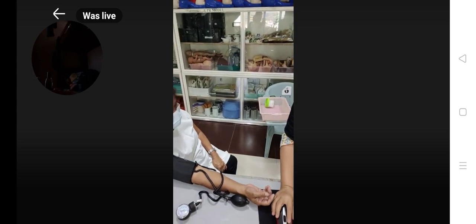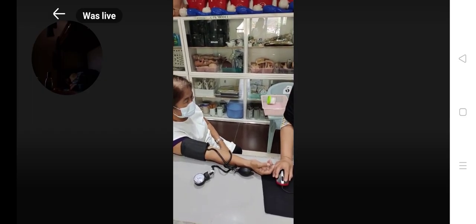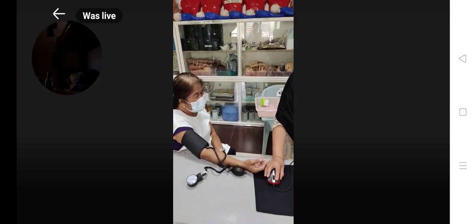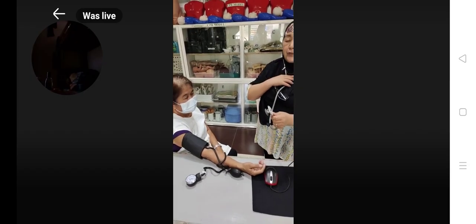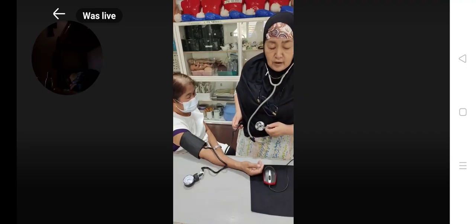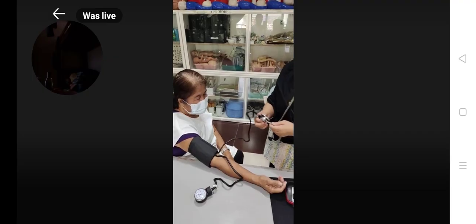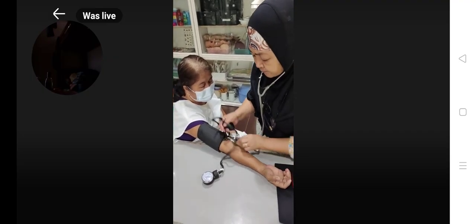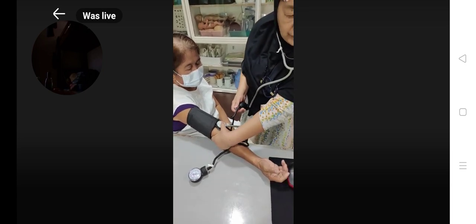After locating the opening on the stethoscope, you have to place the stethoscope directly on the skin of the patient, not on the clothing. Holding the diaphragm with your thumb and your fingers, auscultate the client's blood pressure.